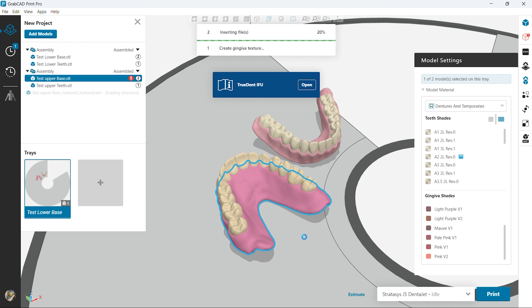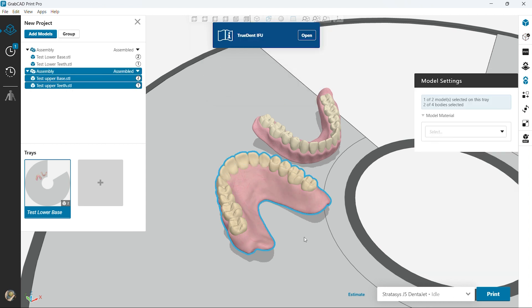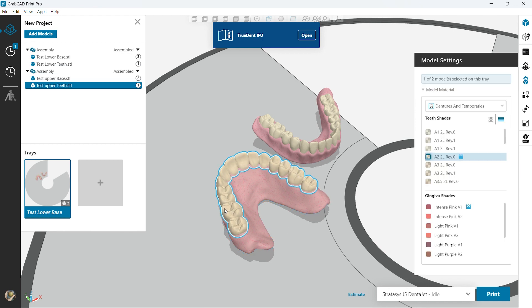There are options in 3Shape to export with the colors already added. We're working on development with Exocad to have a similar feature very soon.